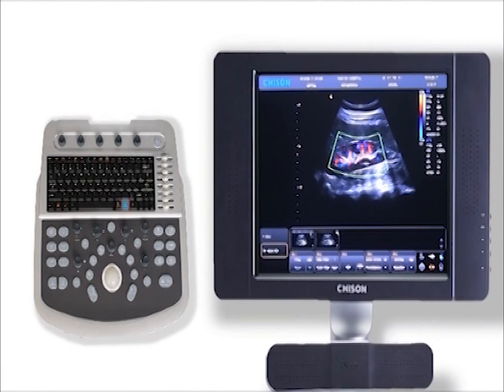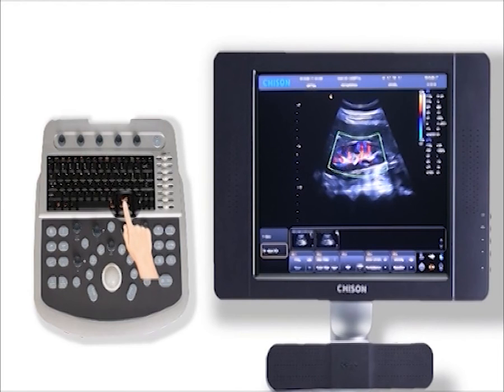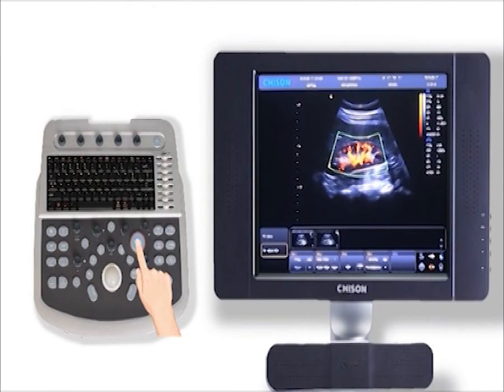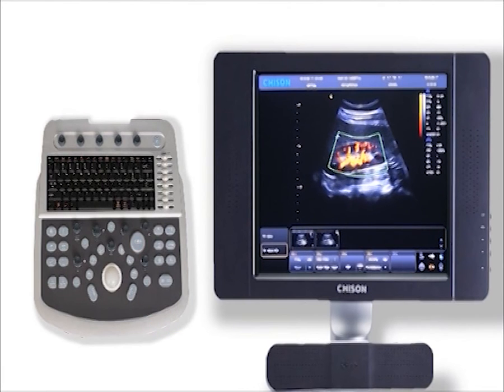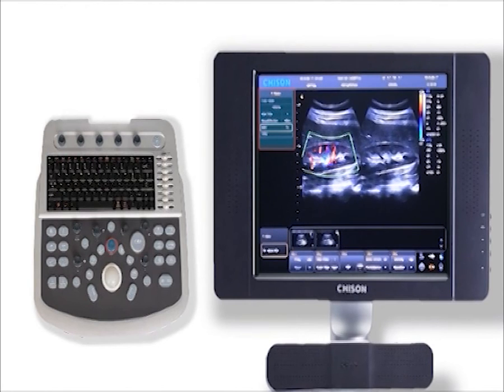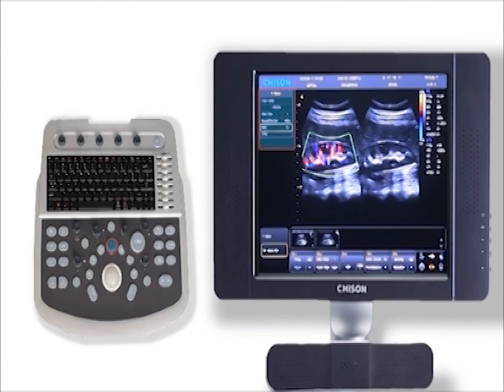We have one smart technology called Qflow, which greatly enhances tiny vessel display with low velocity. Now it's off — click this key and you will see a big difference. Besides color mode, there is a CPA button for color power Doppler. Press this button to turn this function on. Press the menu key to open BBC mode. Press exit key to turn it off.